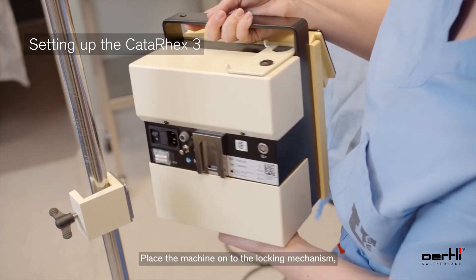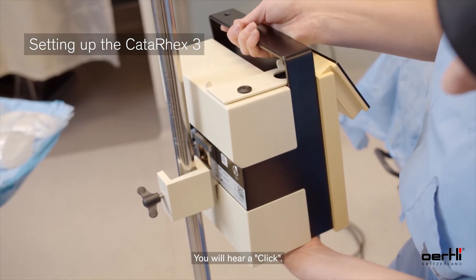Place the machine onto the locking mechanism, ensuring that it locks into place. You'll hear a click.